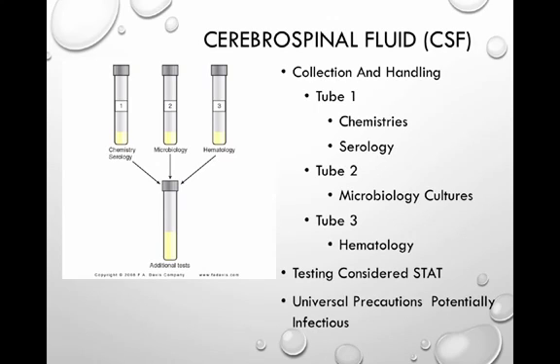All CSF testing is considered stat. So we don't want those tubes lying around at all. And we need to always keep in mind that cerebrospinal samples are potentially infectious as well. So we want to process these specimens in a biological safety cabinet. The gold standard for CSF testing is to perform it stat, and that's within an hour.